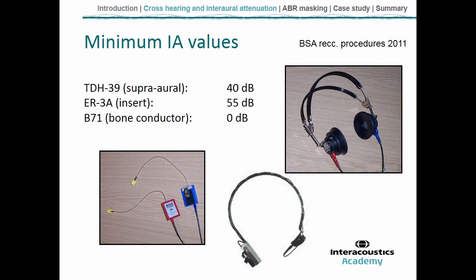So those are where the minimum interaural attenuation values come from, and if you're interested you can have a look in more detail in the British Society of Audiology recommended procedures.